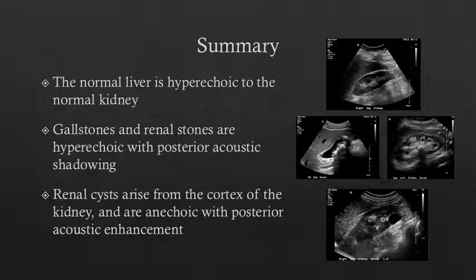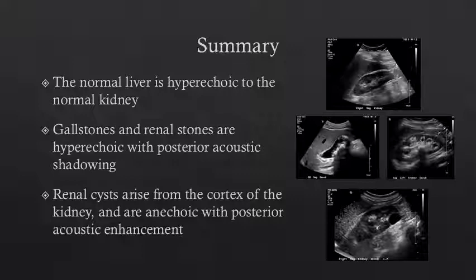In summary, the normal relative echogenicity of the liver to kidney is liver hyperechoic to kidney — in other words, the normal kidney is less bright than the normal liver. Gallstones and renal stones have a similar appearance: both are hyperechoic with posterior acoustic shadowing. Sometimes it can be difficult to differentiate renal sinus fat from a renal calculus, so shadowing is critical and the twinkle artifact using Doppler ultrasound can be helpful. Renal cysts arise from the cortex of the kidney — they should be round, anechoic, and show posterior acoustic enhancement.